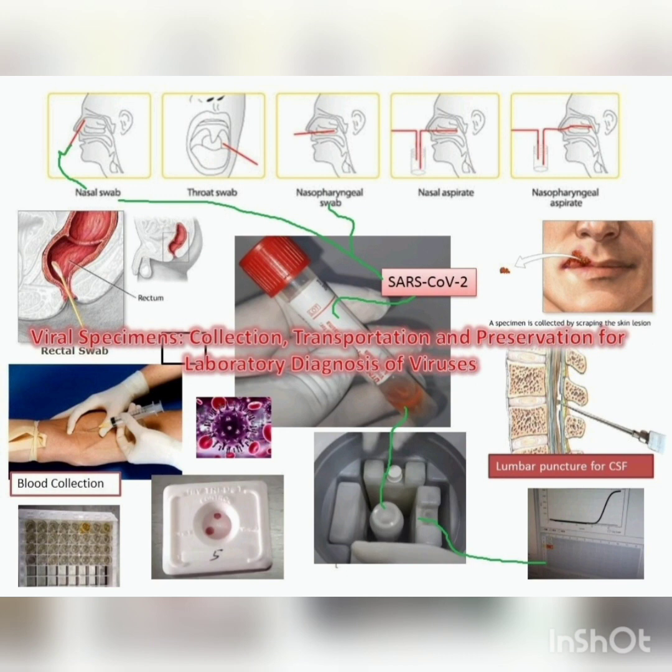And next is prompt delivery of the specimen to the laboratory. Within a specified time period you need to send it without any delay.